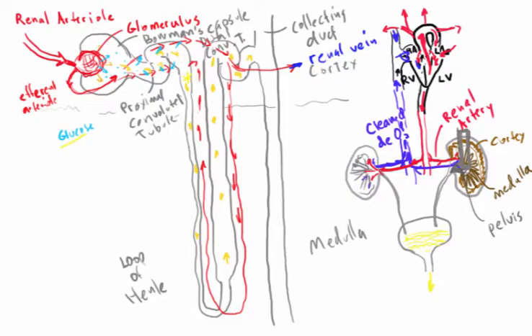Another thing that we might be noting in a couple of ways is the presence of white blood cells, or pus. Pus is the same as white blood cells we talked about in, I think, the last laboratory. So white blood cells, if you remember, are our infection fighters. So if you have any type of urinary tract infection, we're going to be seeing white blood cells going into the urinary tract to fight that infection, and sometimes quite a lot of those white blood cells are going to end up in the urine. And so we'll be running tests to detect pus or white blood cells.